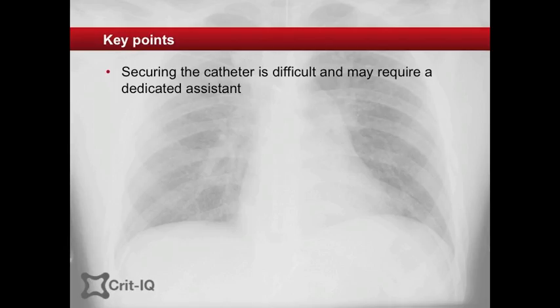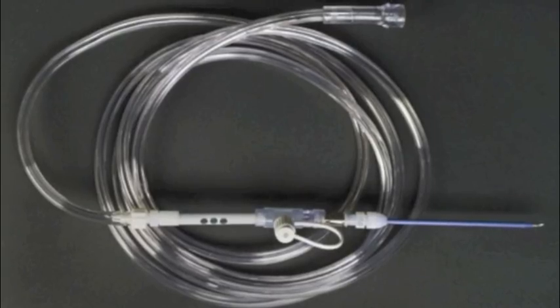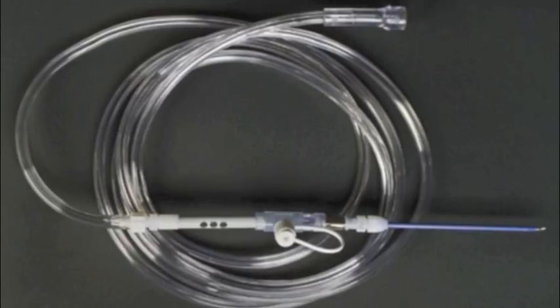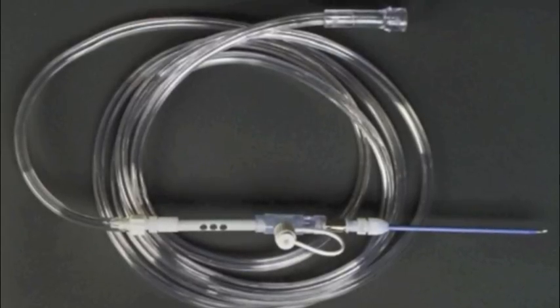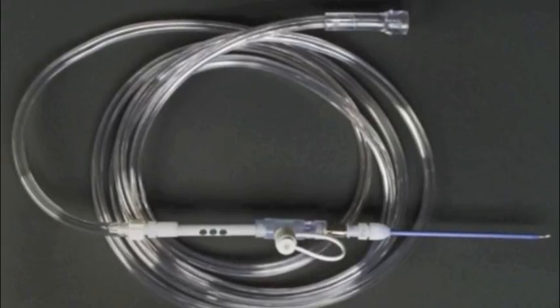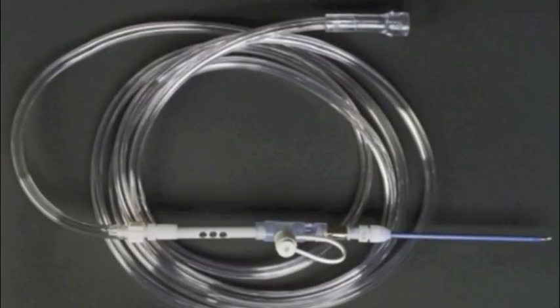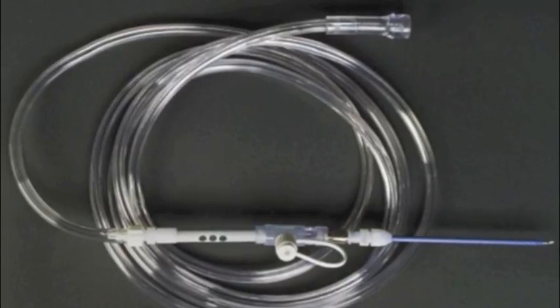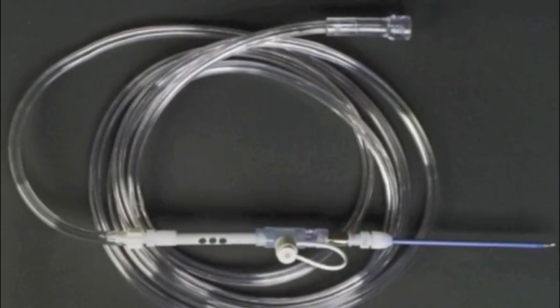Securing the catheter can be very difficult and may require a dedicated person to prevent kinking or dislodgement. Commercial kits have been developed to allow for easy delivery of the high-flow oxygen to the patient. One end is connected via the lure lock to the catheter, while the other is connected to the high-flow oxygen. Oxygen is delivered by occluding the holes, as shown here.